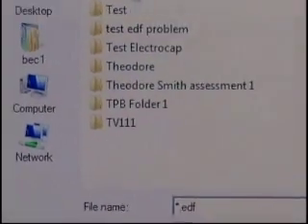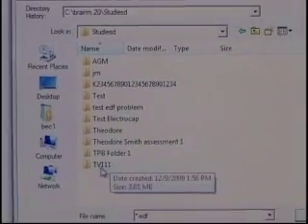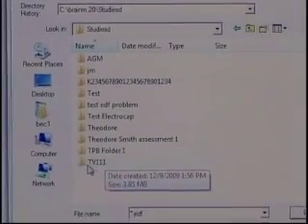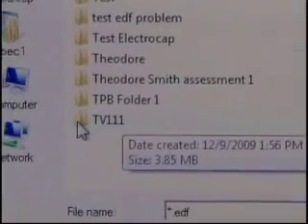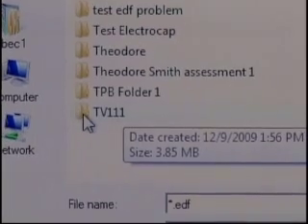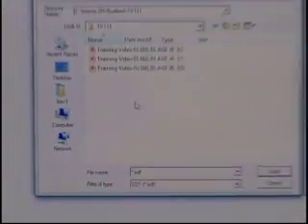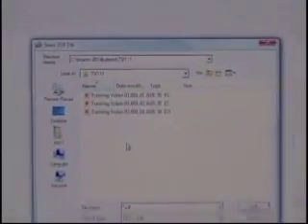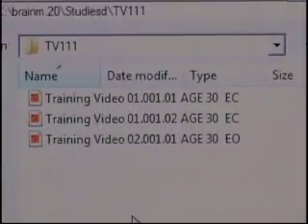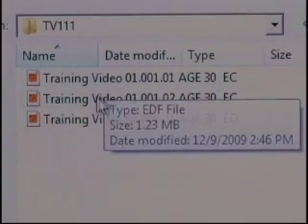Now I have my online Discovery files and I see TV111, so I open that subdirectory, TV111, Training Video. Here are my three EDF files. I have my first two minutes, eyes closed. I have my second two minutes, eyes closed.